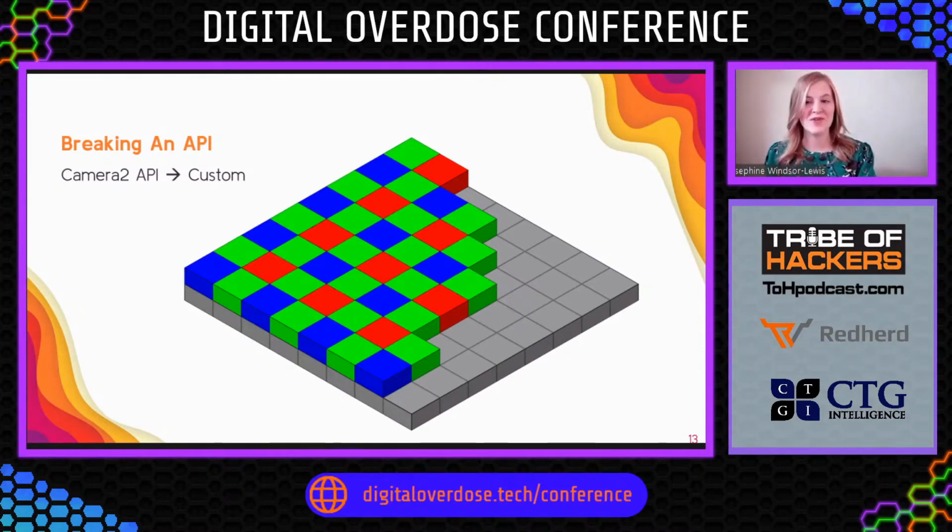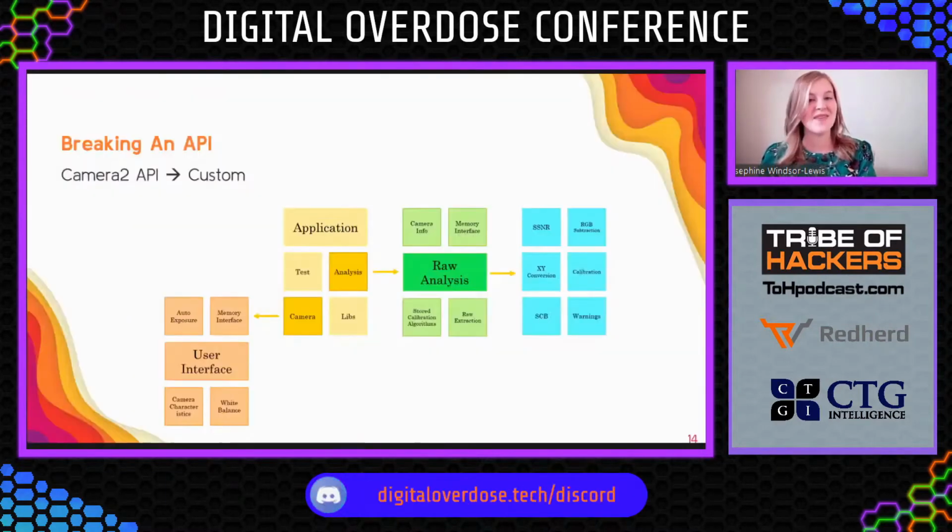It's quite tricky. So we built a custom module to convert from raw sensor image data to a TIFF. That's a tagged image file format, a TIFF 6 specifically, which is a standardized raw image format. Currently, this is only hard-coded for a couple of phone models, the Samsung S8 and the Nexus. But in future production, we hope that this can be widened to a whole range of different phones.